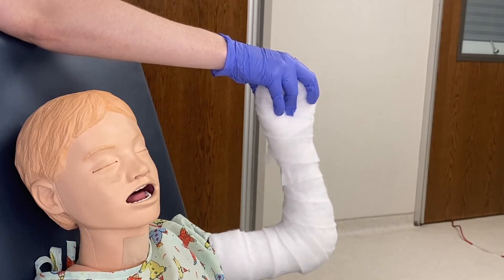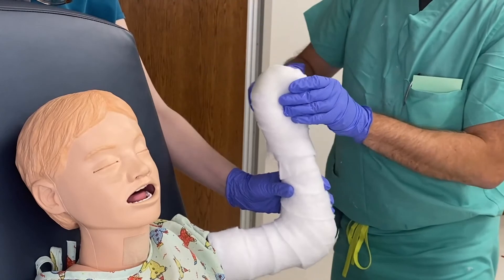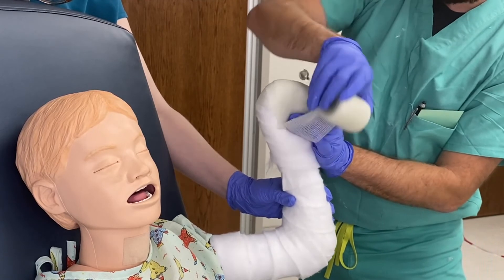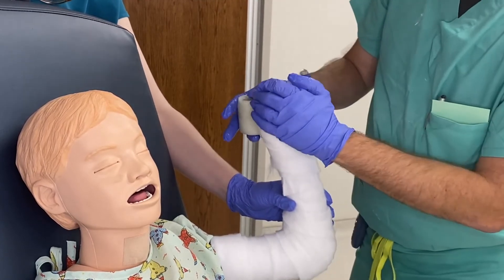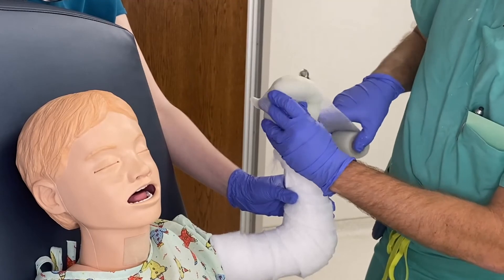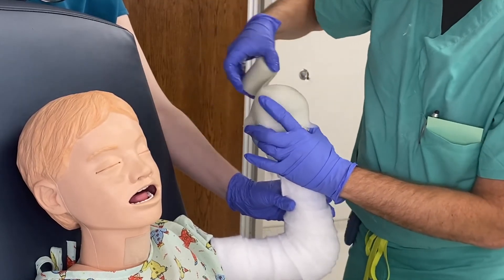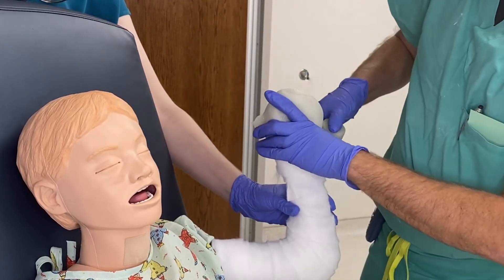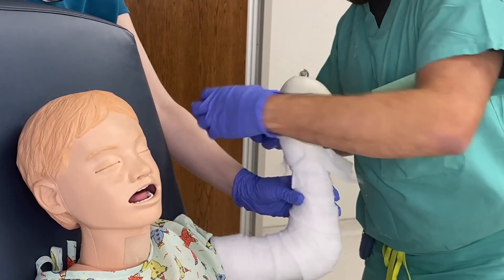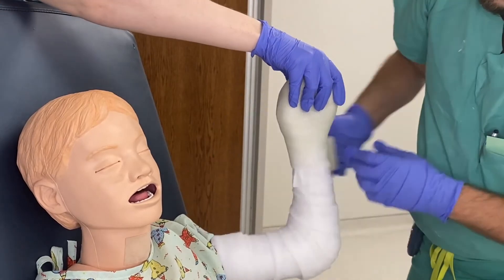Now we're onto the fiberglass — same technique as you did with the cotton. We're going to start at the hand, 50-50, making sure there are at least four layers, and smooth it down. You can also do it the other way — whichever way you feel comfortable doing. Once you get that done, start going down 50-50, remembering that 50-50 overlay.